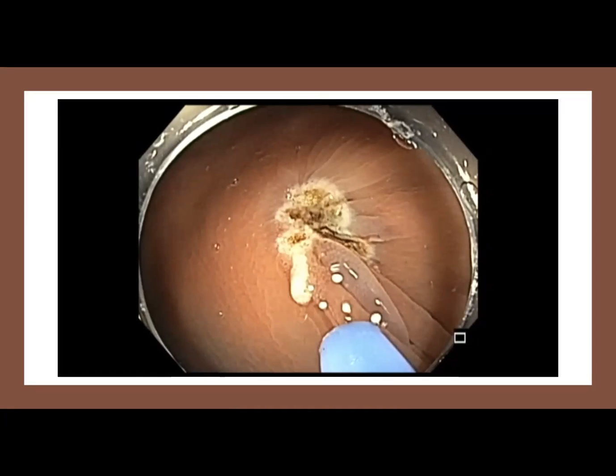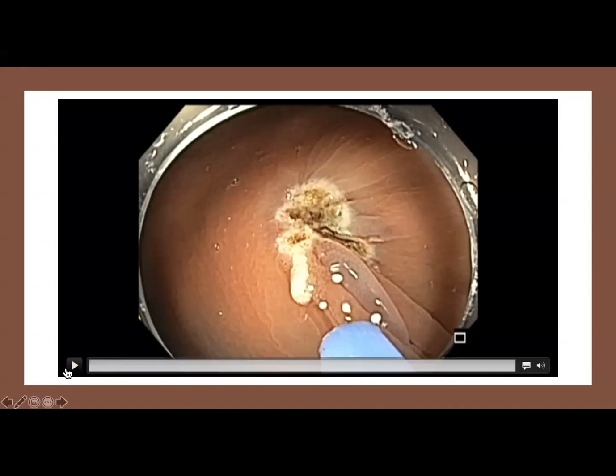And the second most common cause for perforation is the delayed perforation after APC in the cecum. So something to keep in mind. So any comments on that, Roy, Sylvia, Selby? What do you guys think? It's beautiful. Clip it. Okay.